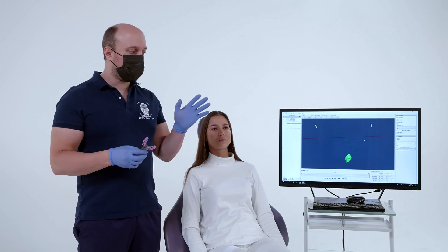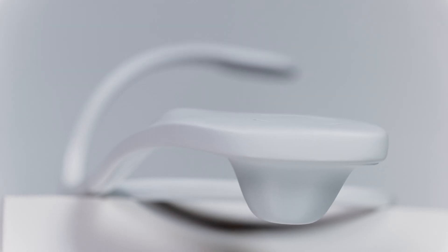Fixing of equipment for axiography. At this stage, you should have information from digital arch data and dentition scans. We use the ProAxis device to record movements. This is an optical axiograph.